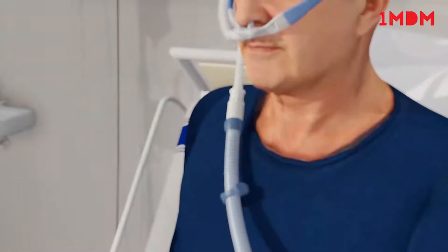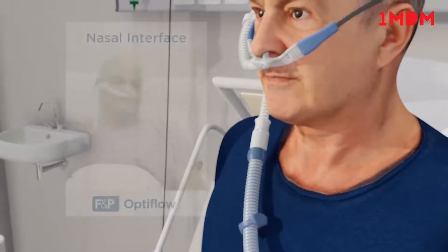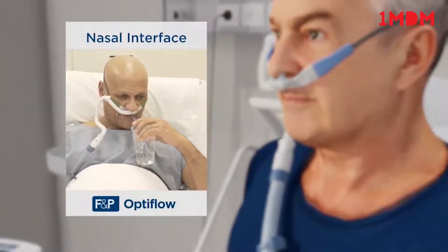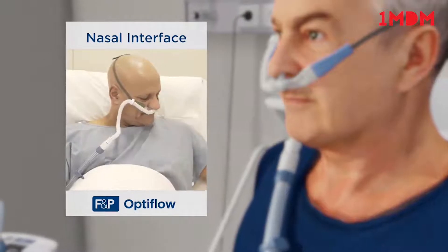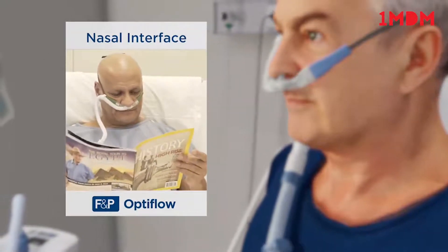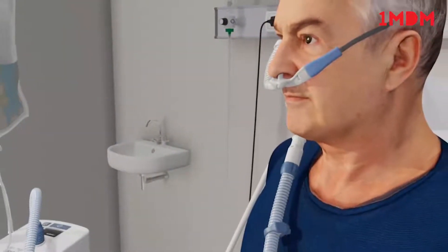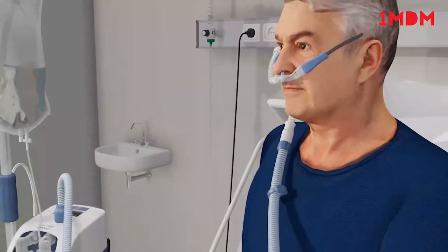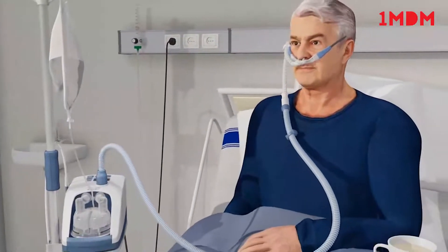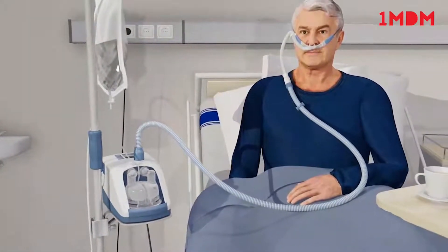The respiratory gas is delivered using an OptiFlow patient interface. If using the nasal cannula, the patient can eat, drink and talk during therapy, which may help patient comfort and compliance. The Evo2, together with our OptiFlow range of patient interfaces, provides a versatile and easy-to-use system for delivering humidified high-flow therapy.